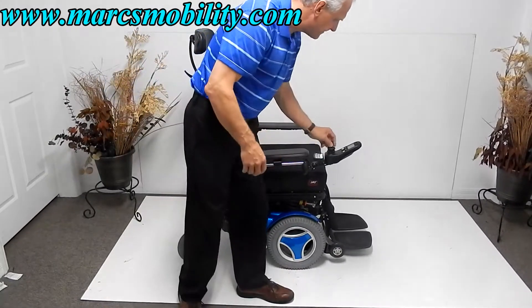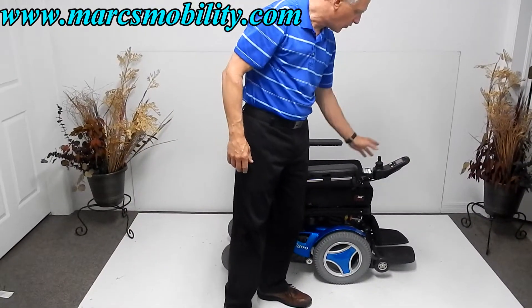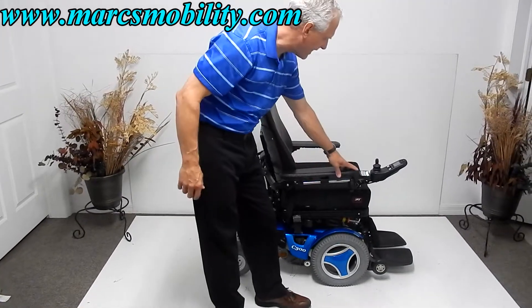It's a very sharp looking chair. You can work all the functions through the joystick, or you can work them through the box behind the joystick. I'm going to demonstrate all the functions through that box.